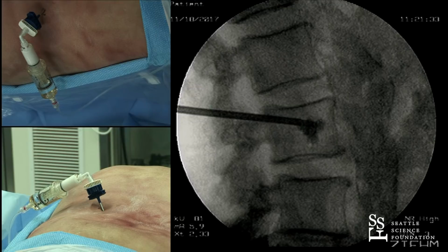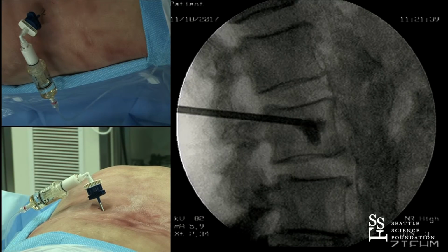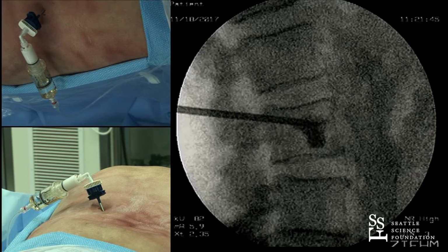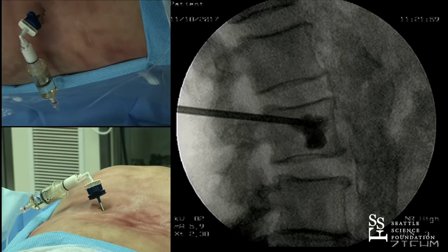So nice cement distribution. This is a hydraulic system with pressure and fluid that transmits to a cement cartridge, and the cartridge injects through a coaxial injection device, and it's perfect consistency. Nice work, Jason. Got it. Yeah, thanks. And we have a very nice distribution.